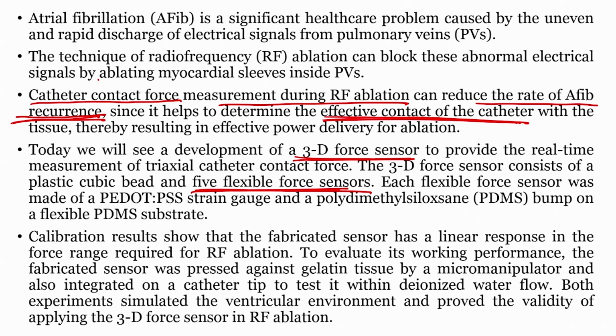We have calibrated the fabricated sensor and it is showing a linear response in the force range required for RF ablation, and to evaluate its working performance, we have tested the fabricated sensor against gelatin. Gelatin is called phantom tissue, not real tissue. You can create gelatin in the laboratory and test your fabricated force sensor. To press the force sensor against gelatin, we have used a micro manipulator. We will see the use of the micro manipulator, and also integrated the sensor on a catheter tip to test it with deionized water flow. So, we have tested the catheter in the water.